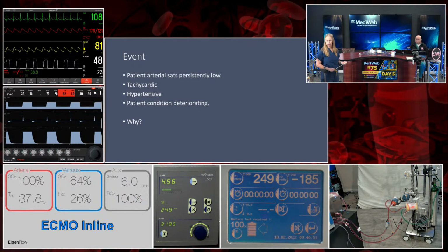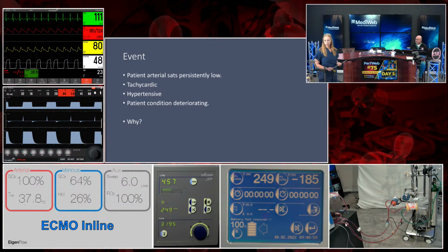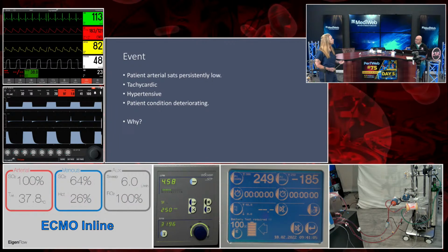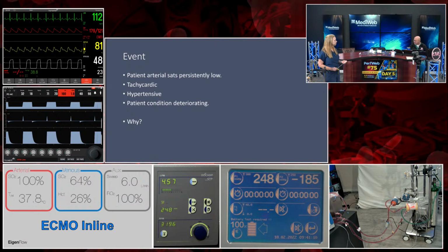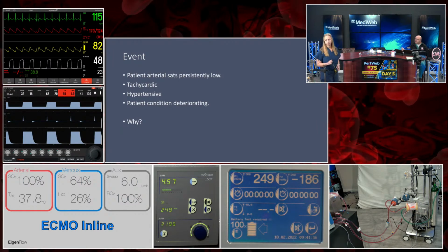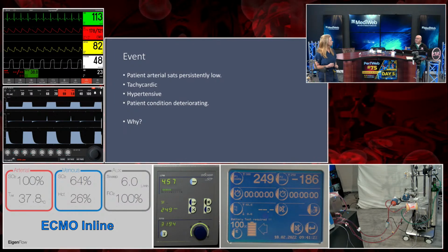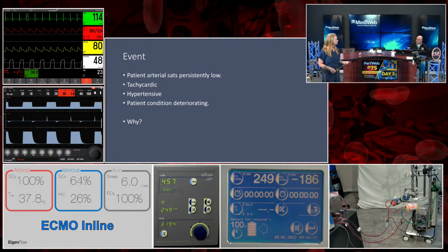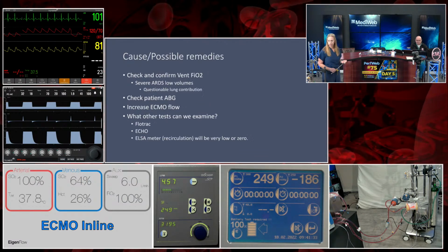Now, another thing we could try to do is decrease the temperature. If we decrease the temperature of the patient, which we really can't simulate here at this time, you would, of course, decrease oxygen requirement demand, and you would get some incremental increase in your saturation. I think I said 38.8, so we could drop that down to 36 and reduce the metabolic demand by 14%. But is masking a temperature necessarily the right answer? Is that really what's going on here? Remember, the patient was given labetalol for the hypertension, which has not been very effective. So let's take some considerations and think about some other things.